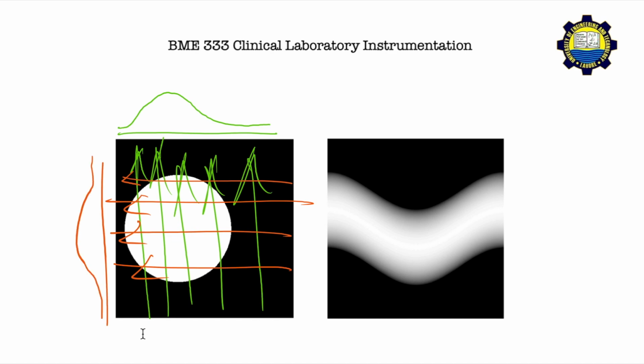Projections would probably be centered like this. So you could see when you stack these projections up, one projection at one angle is towards the left hand side from the center, whereas in another projection the bulk of information is at the center. So that is what we try to do.